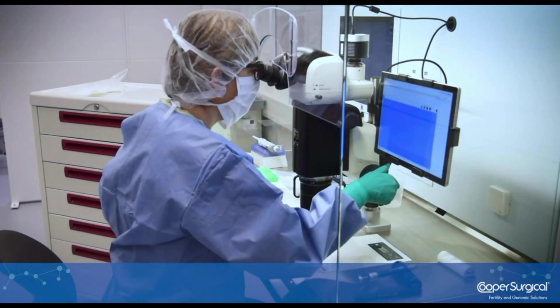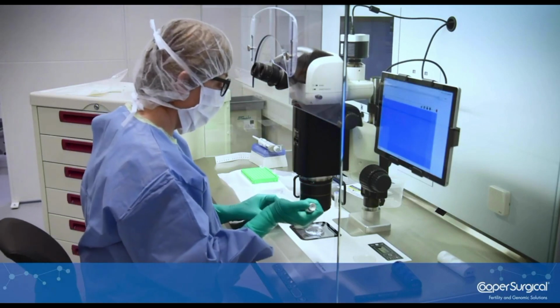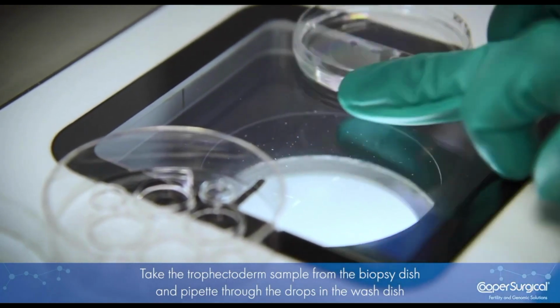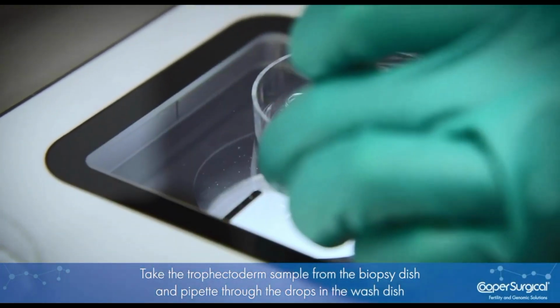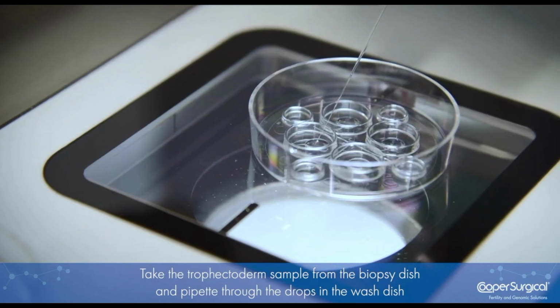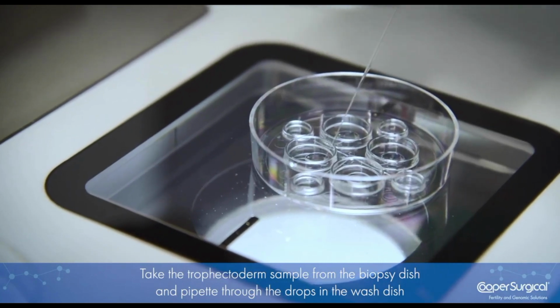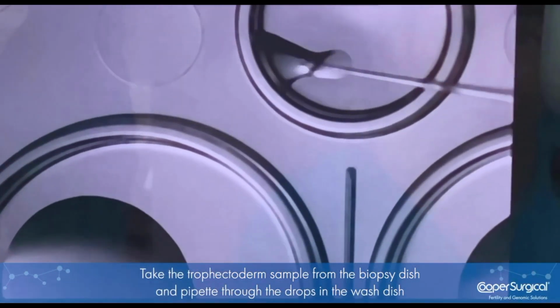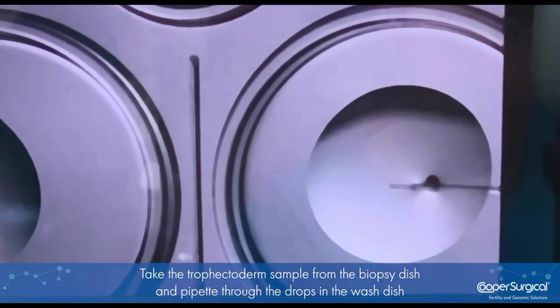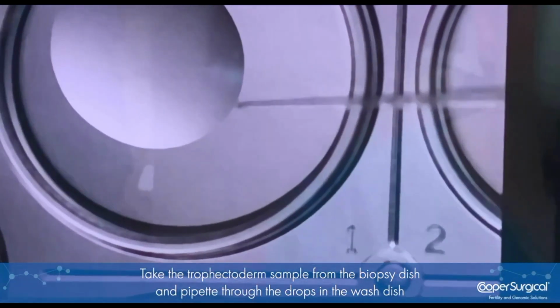Now we are taking our biopsy dish itself. We prime the pipette, and we will transfer the sample from droplet number 2 to the first washing drop. We keep on monitoring through the stereo microscope, and we try to avoid making any bubbles, because that will make life much more complicated when moving the sample. So we expel the content, or the excess content. We will take fresh medium from the next drop, and then we will move back to our sample. We will aspirate the sample.